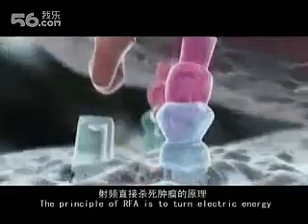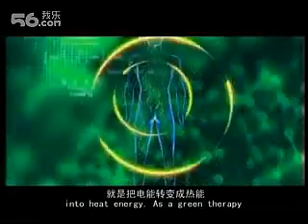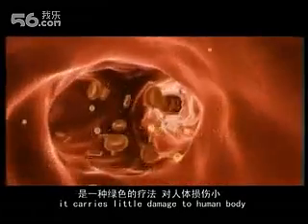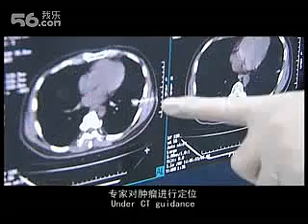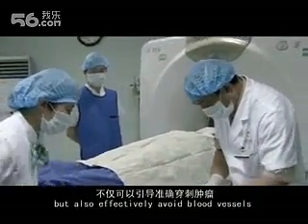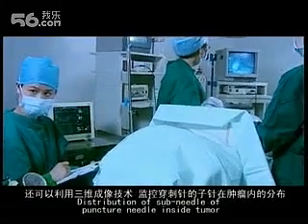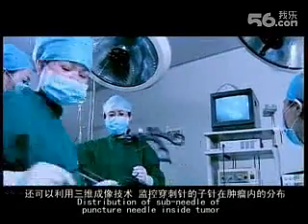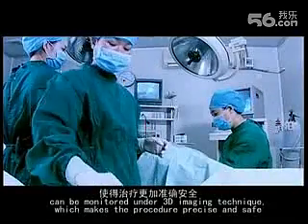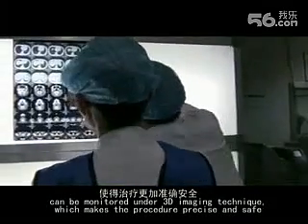When the temperature reaches 80 to 100 degrees centigrade, the tumor will be trapped by the heat, leading to death of tumor tissues. The principle of RFA is to turn electric energy into heat energy. As a green therapy, it carries little damage to the human body. Under CT guidance, practitioners can precisely perform puncture to the tumor while effectively avoiding blood vessels. The distribution of sub-needles inside the tumor and the relation of the ablation electrode to the tumor can be monitored under 3D imaging, making the procedure precise and safe.